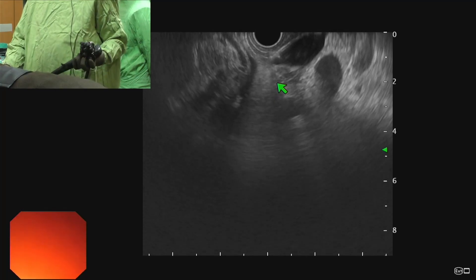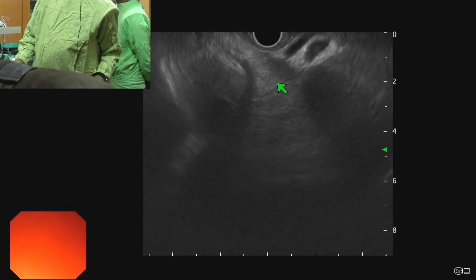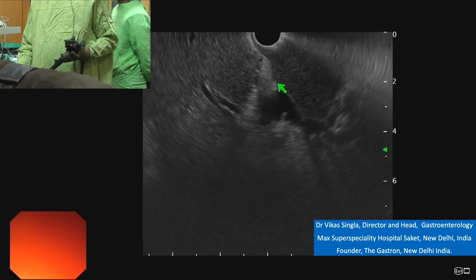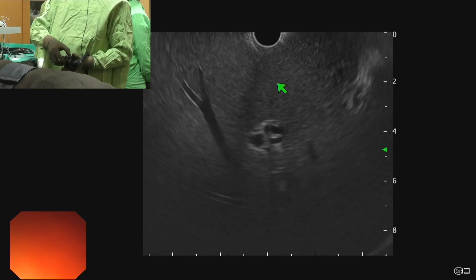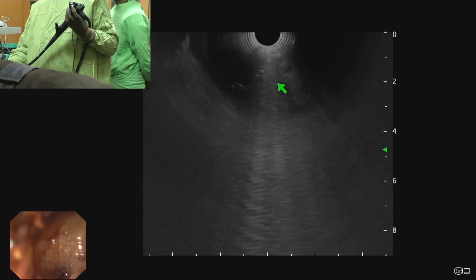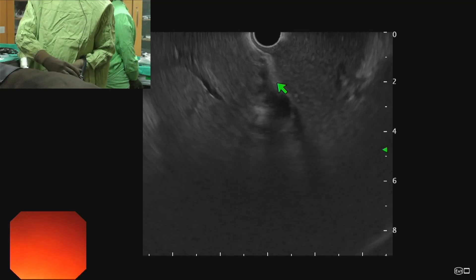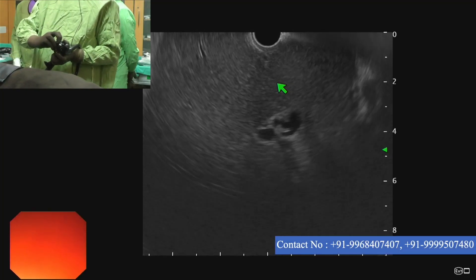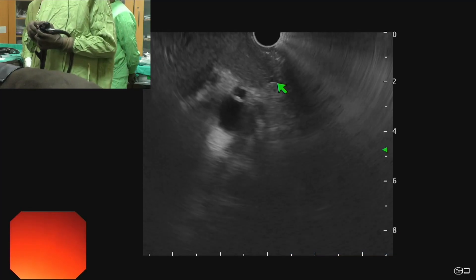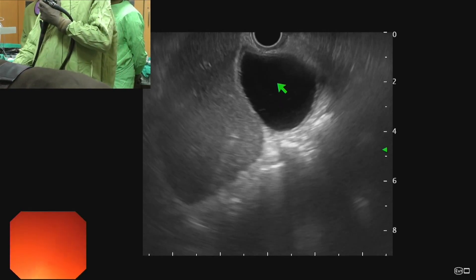Dropping the left hand, we go towards the liver hilum, and raising the left hand, we go towards the ampulla. Dropping the left hand again, we go inside the liver. If we want to see the gallbladder, the movement should be down, left, and counterclockwise. We go into the first part of duodenum, drop the left hand, and the up-down knob should be down and the left knob should be left. So this is the gallbladder.